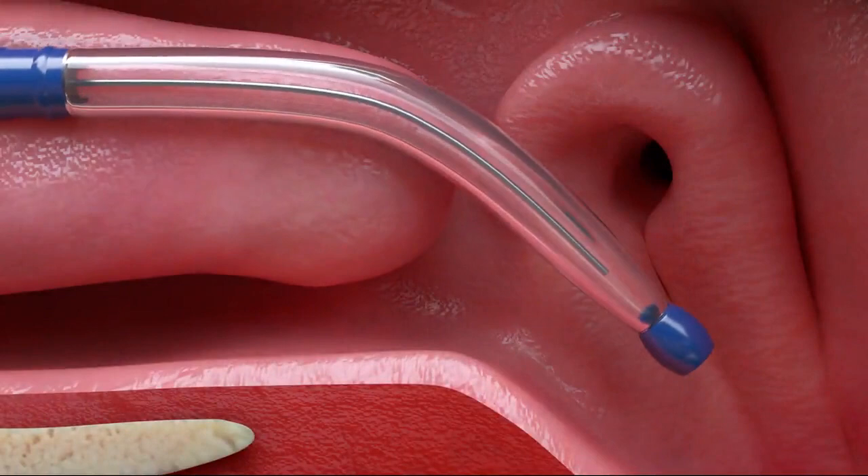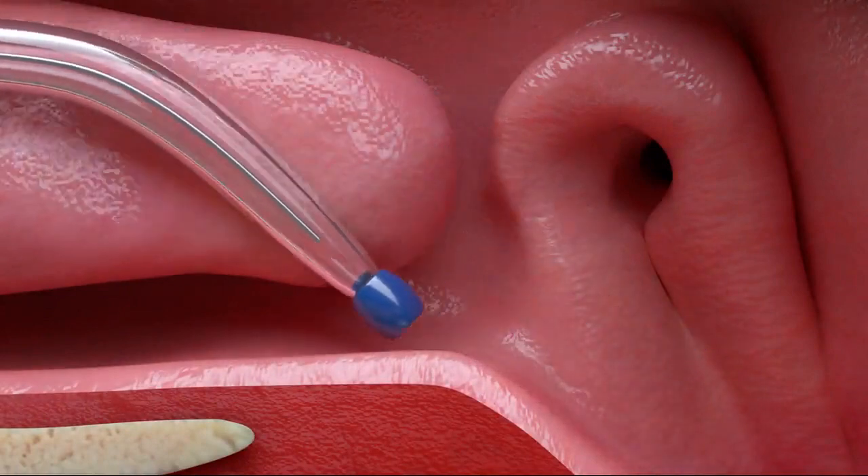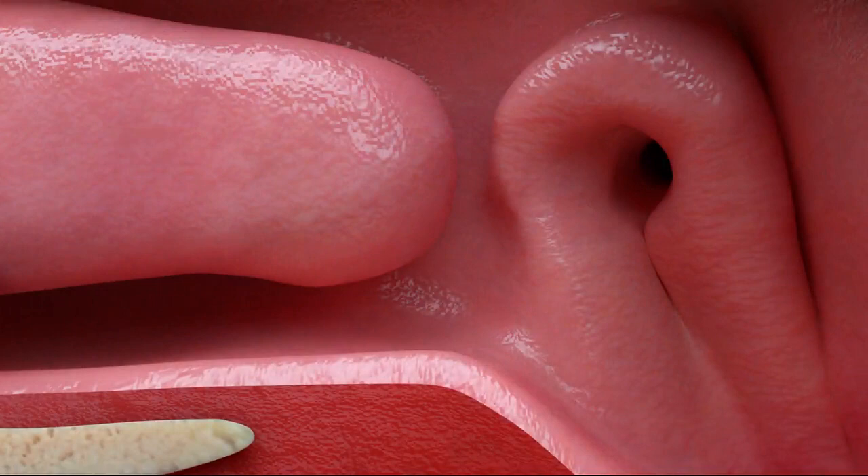When the balloon is fully evacuated, gently remove it from the eustachian tube canal, following the same trajectory used to advance it.